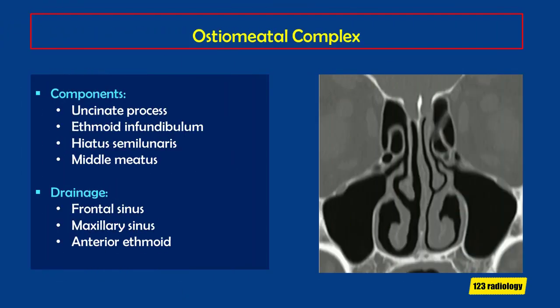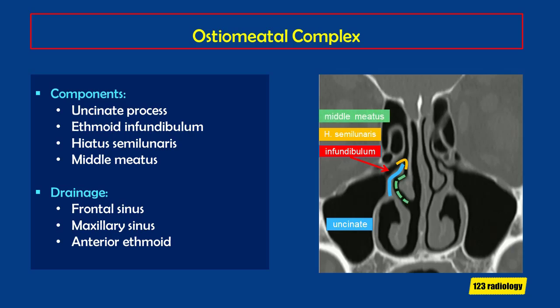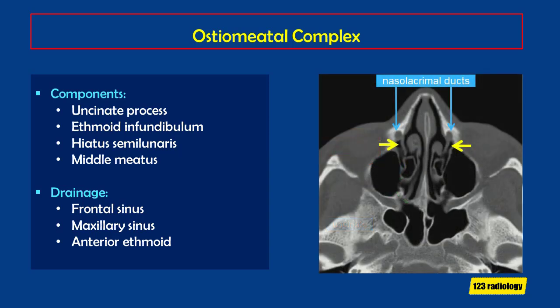The ostiomeatal complex is depicted well on coronal images. The landmark important to recognize is the centrally located uncinate process — if you find the uncinate process, you are close to the ostiomeatal unit. The air space lateral to the uncinate process is the ethmoid infundibulum. Right at the tip of the uncinate process is the hiatus semilunaris. The middle meatus is medial to the uncinate process and lateral to the middle turbinate. The dominant ethmoid air cell above the uncinate process is the ethmoid bulla. Importantly, the uncinate process anteriorly has an attachment to the nasolacrimal duct, so the nasolacrimal duct can be at risk during resection of the uncinate process.